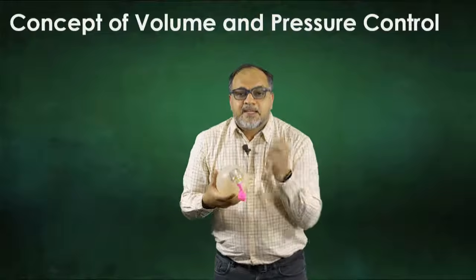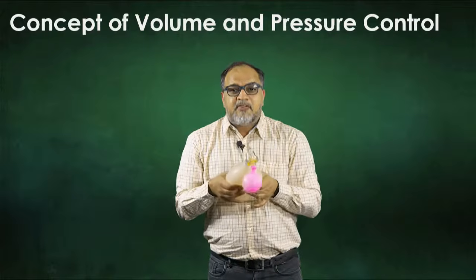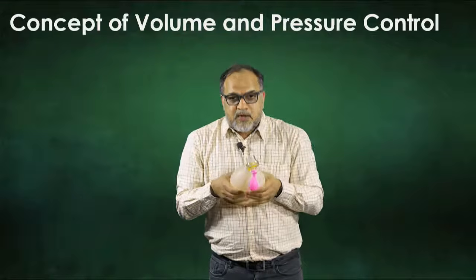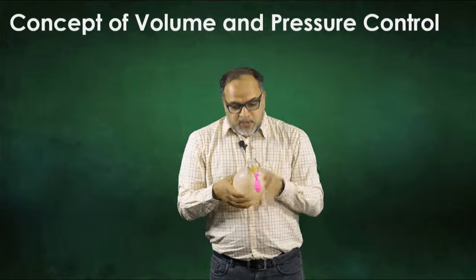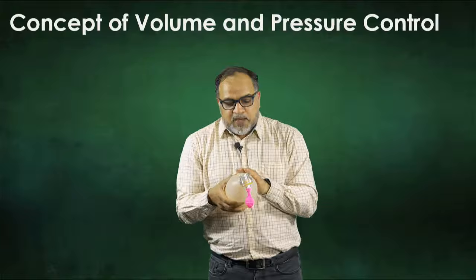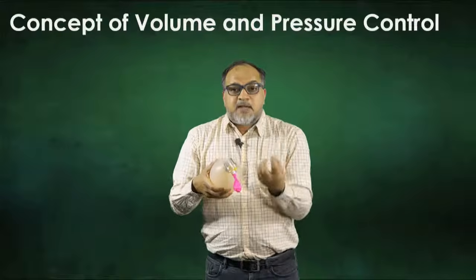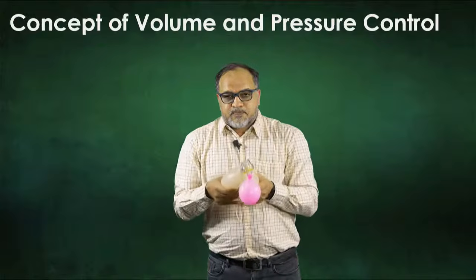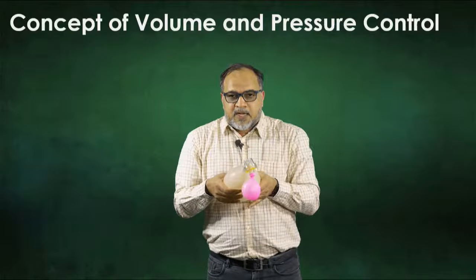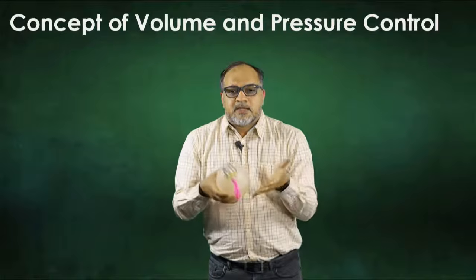They are getting tight. Where is this pressure coming from? My ventilator. The more tidal volume I give, the tighter the balloon gets. More the tidal volume, more the pressure. Small tidal volume, small pressure. Larger tidal volume, larger pressure.